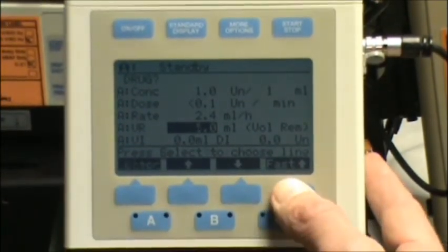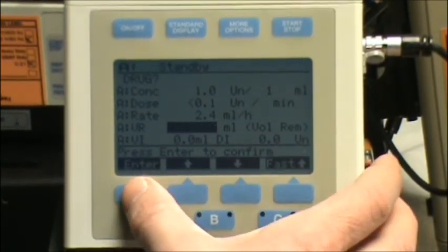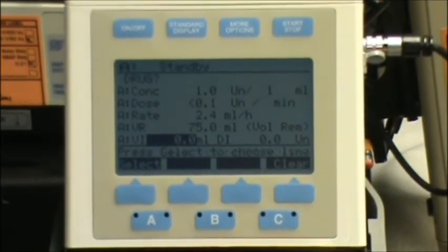Volume remaining. I'm just going to simulate I have a 100 ml bag. Put in 75 so my tubing doesn't run dry. And then press start.